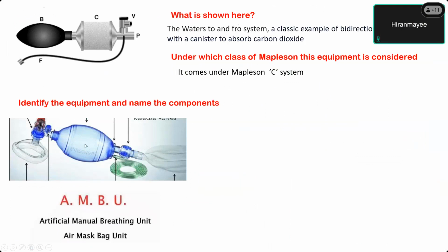Self-inflating bag. Very good. What is this green tube? Where will you use the green color tube? O2 delivery. Correct. It's an international coding for that. The O2 delivery tube should have green color.